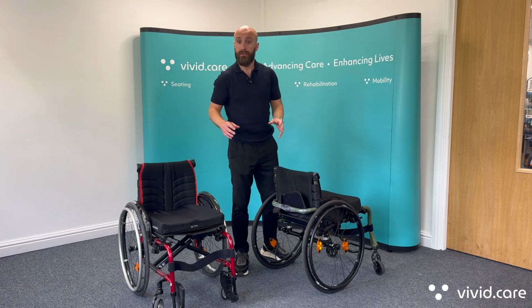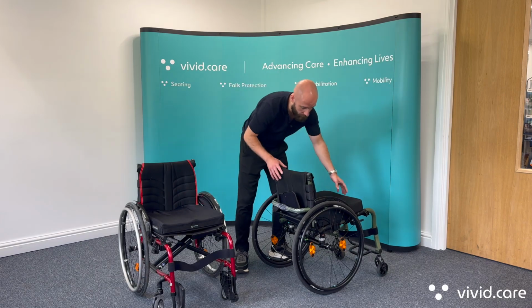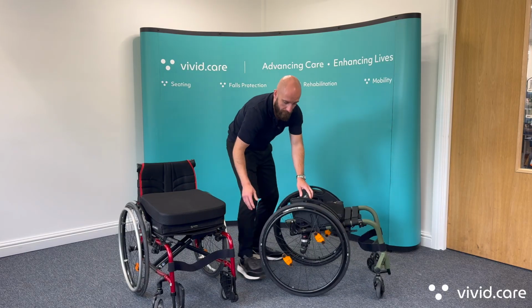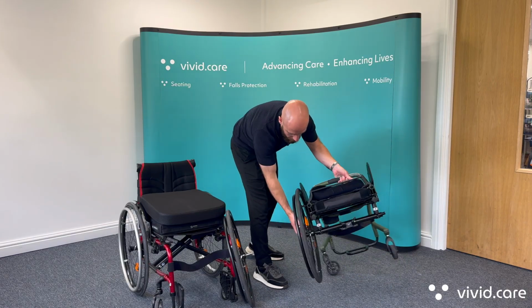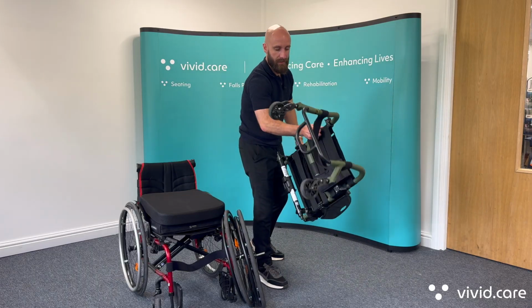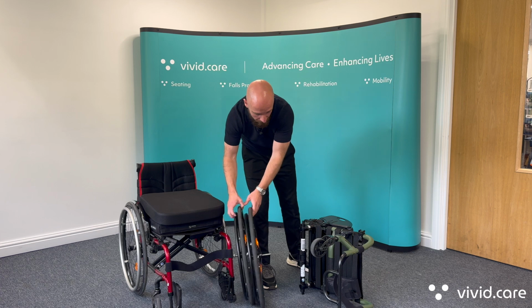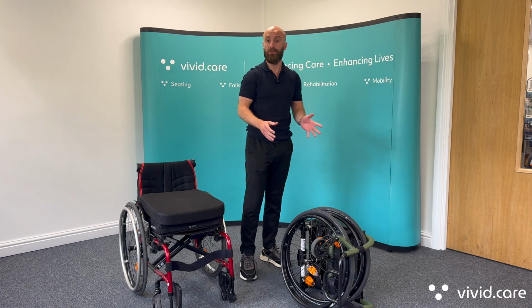A lot of people do often say to me, well, does that mean it doesn't fold down at all to get into the car? Which isn't strictly true, because what happens with these chairs is the backrest tends to drop over like this, and then of course what you can then do is take off the wheels. So these are quick release wheels on both sides, so you can take those off, and then you're left with a very nice lightweight compact frame, which can actually slot into cars very nicely, because that part can go in and then the wheels can be slotted in and around it, so it doesn't take up as much room as you imagine.